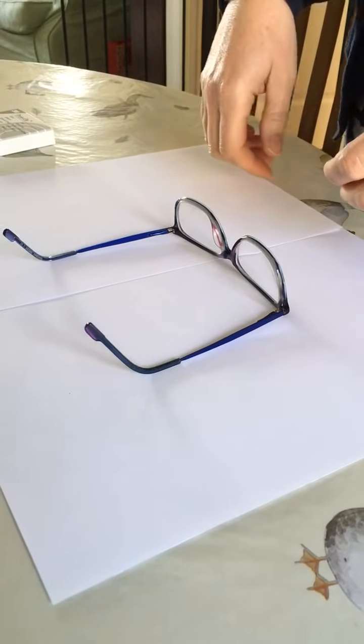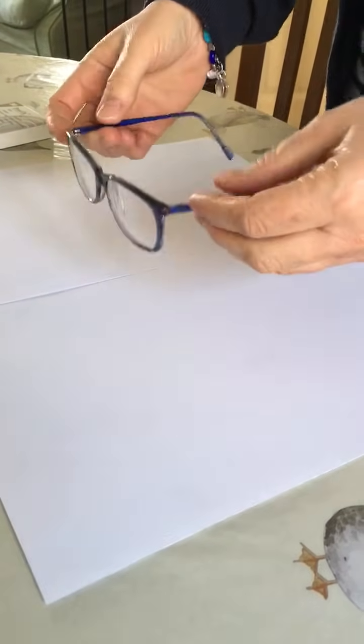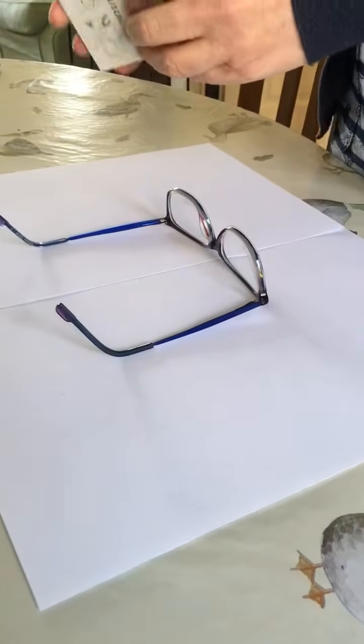We're going to fit a Fresnel Prism on your glasses. It's slightly tricky but we'll give it a go. First of all, make sure your glasses are nice and clean and get your prism that you've probably been sent in the post.